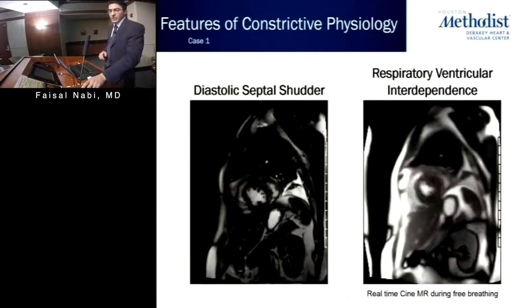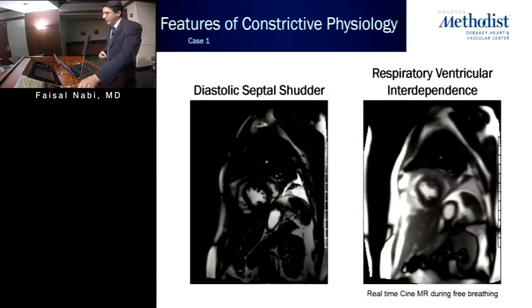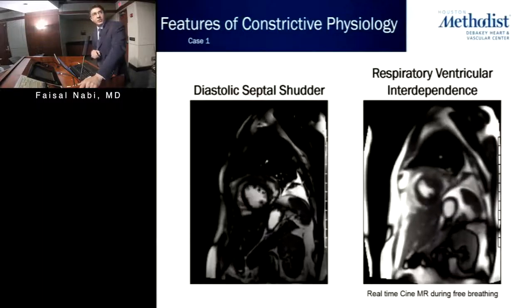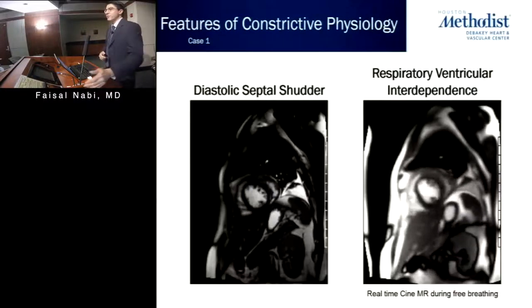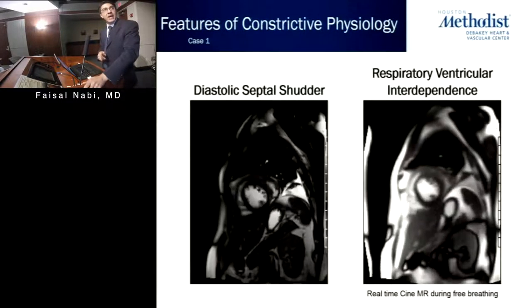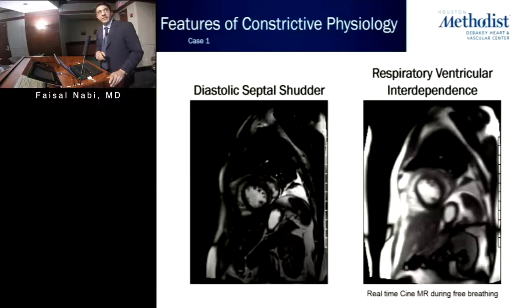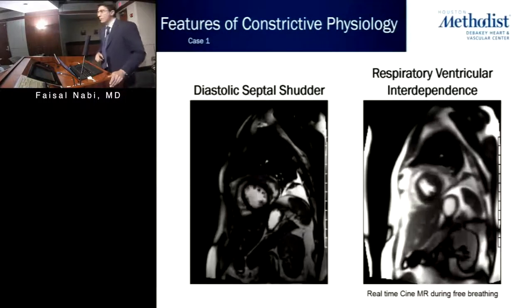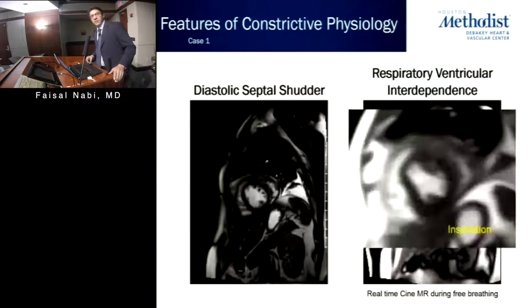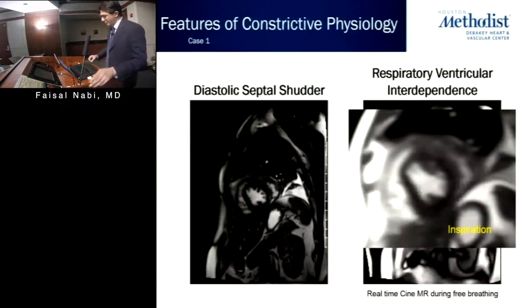Other interesting findings that we noticed on this patient were that this patient was now having evidence for constrictive physiology. And I'll go a little bit more into this in our next case. But in brief, I hope you'll appreciate there's a diastolic septal shudder there, which shows the close ventricular interaction that this heart now has when it's confined by a very thick pericardium. And on these real-time cine free-breathing techniques, I hope you'll appreciate the movement of the septum with respiration. I know it can be difficult sometimes when these movies are playing, but just on a still image here with inspiration, you can see movement of the interventricular septum towards the LV.